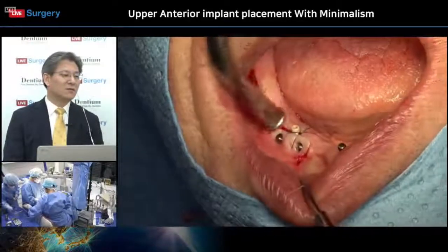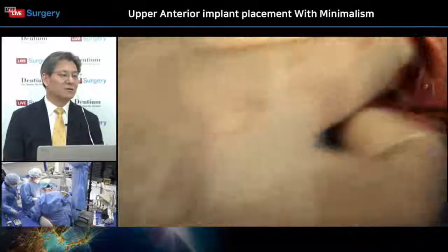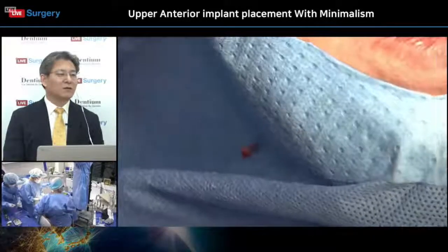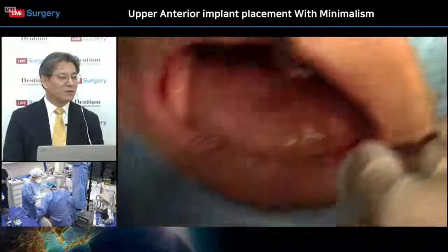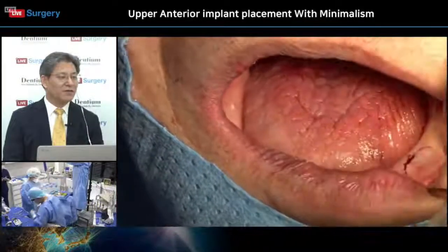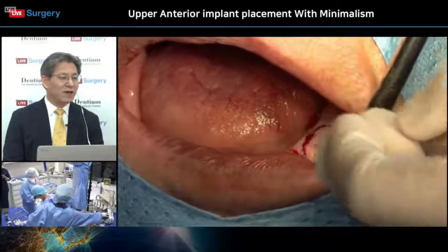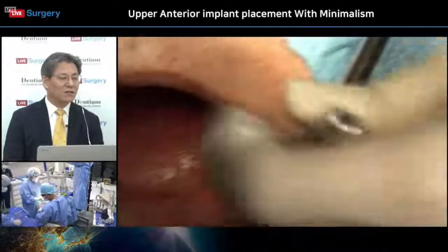And the side. Yeah. I'll relieve the denture on this side later. Okay, so we finished the number 46 area, and now we're moving to the number 36 area. I think he is doing a similar technique on this side.